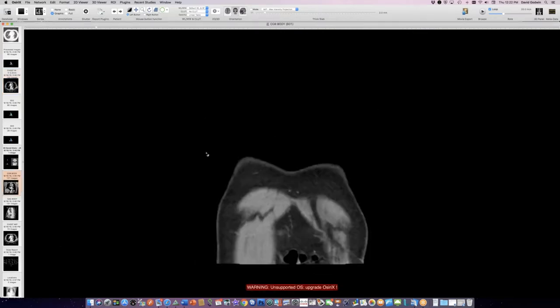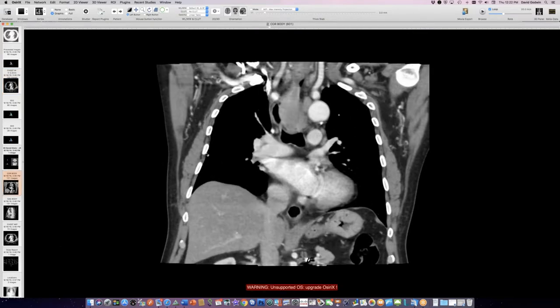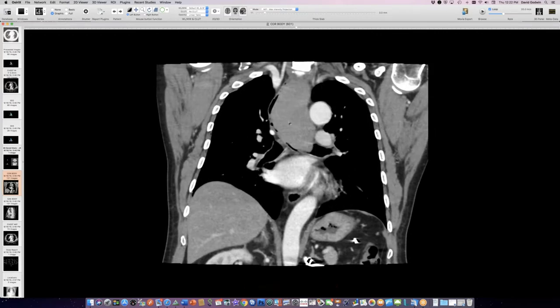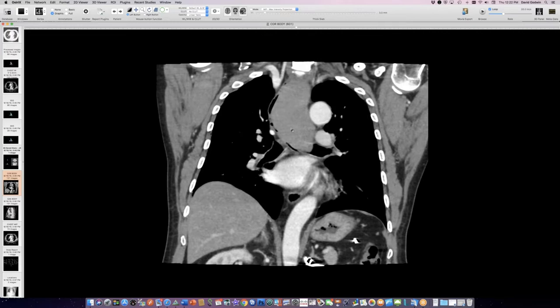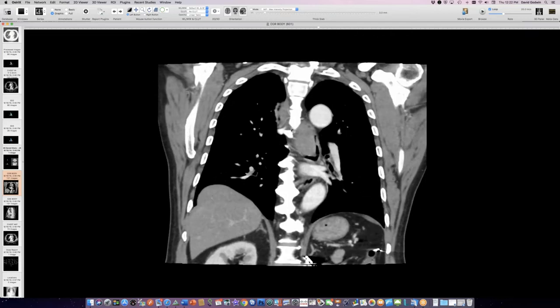Has anyone seen an esophageal lymphoma that looks like this? We've seen lymphoma before, but not pedunculated. You'd think of fibrovascular polyp — some of them are a little lower attenuation. Or even a large leiomyoma, though those are usually submucosal rather than mucosal. The teaching point from residency is that when you see a bulky esophageal tumor that's not adeno or squamous cancer, consider something in the muscle series like leiomyoma or lymphoma. But this is the first intraluminal polypoid version of that.